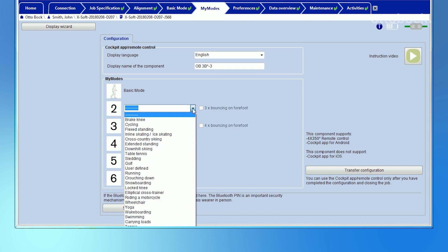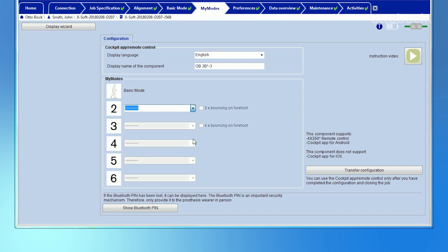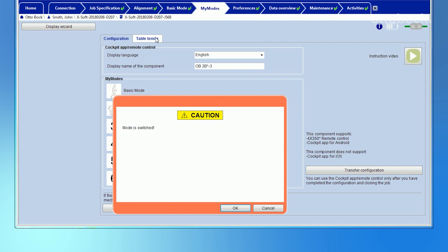The CPO can choose from different preset My Modes and each of them can be customized. In this example, Table Tennis is selected for the first My Mode in the drop-down menu. When clicking on Table Tennis, a warning message pops up that the mode will be switched from Basic Mode to the selected My Mode. Confirm this with OK.